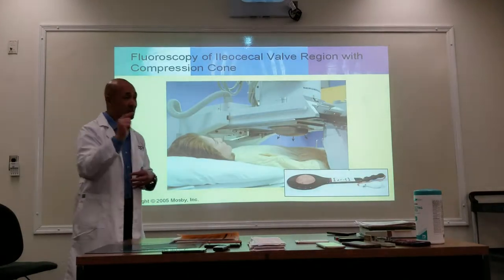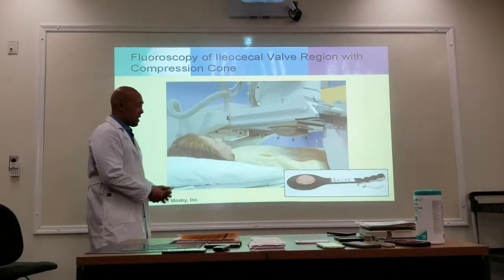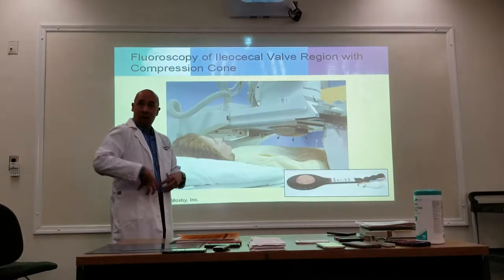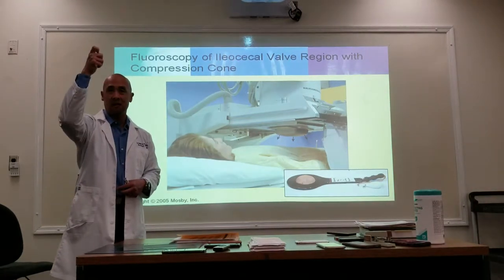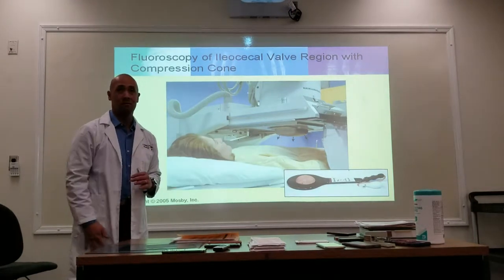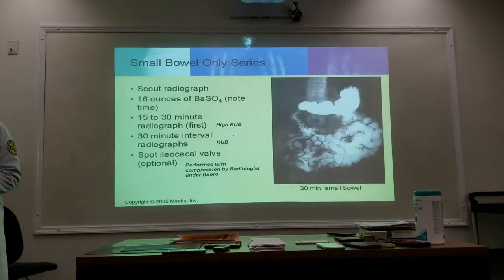So again, once you start filling up the area, but to be sure that we're in the right place, that we are seeing the entire small bowel, the doctor's gonna come in with the fluoro machine, compress the abdomen to spread the bowels around and focus just on that ileocecal valve. Take a snap of it, a spot film, and now we're done. Okay.